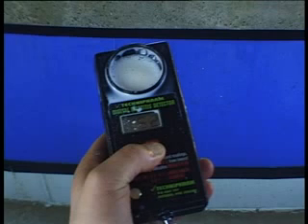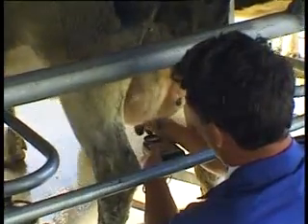Individual quarter readings have no meaning other than a reflection of the chemical makeup of the milk, including milk solids. However, your tester will have to be able to read high enough in order to test colostrum or late season milk. With the all new milkchecker, readings are kept in memory, so you just test each quarter without having to look at or remember the individual readings.